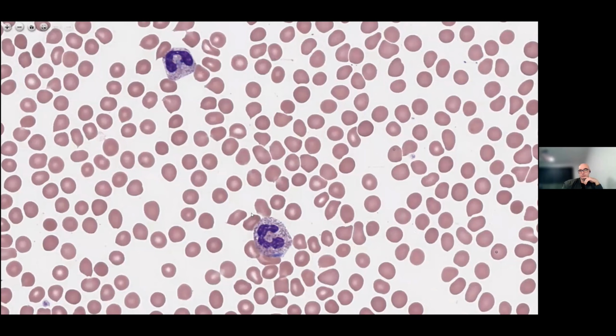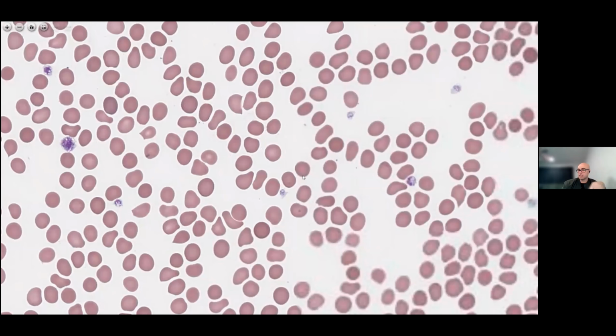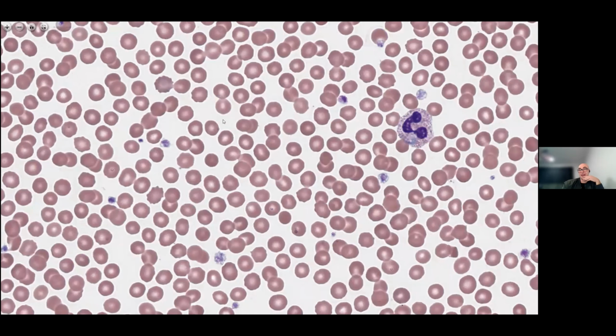So that's when the marrow is starting to pump out more neutrophils, and they're not as matured, but they're still a fully functioning mature neutrophil. It might be an inflammation and infection process, but just my academic interest, I would definitely be referring this one to a hematologist at my laboratory, just going query May-Hegglin anomaly.